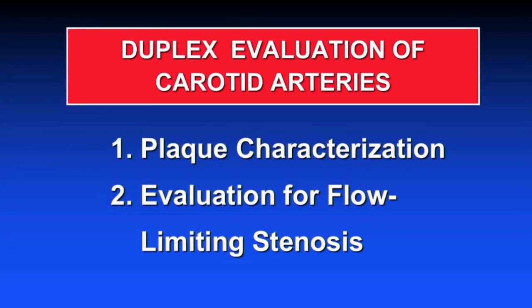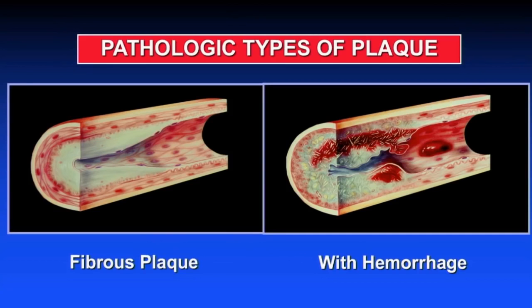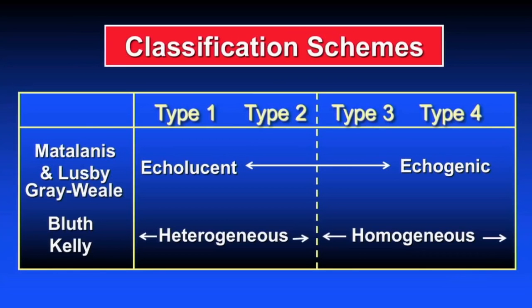embolic stroke. So with pathologists, for a long time, they've well understood that you can assess and identify plaque which is of two different components. One is just simple fibrous collagenous plaque, and the second form of plaque is fibrous collagenous plaque, which has areas of intraplaque hemorrhage. So one of the ideals of imaging is to determine the different forms of plaque, and can we successfully do this with imaging. And I'm here to tell you that actually with ultrasound we're very successful in characterizing plaque, and I've written extensively about this as well as others have done this as well.